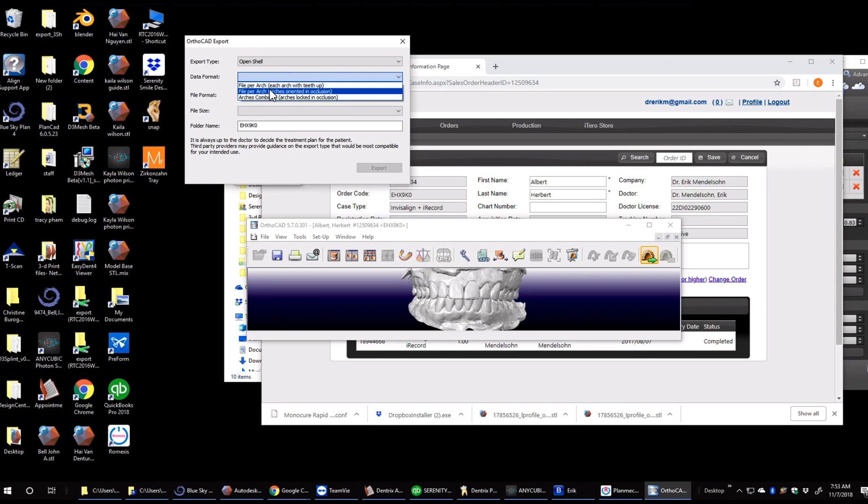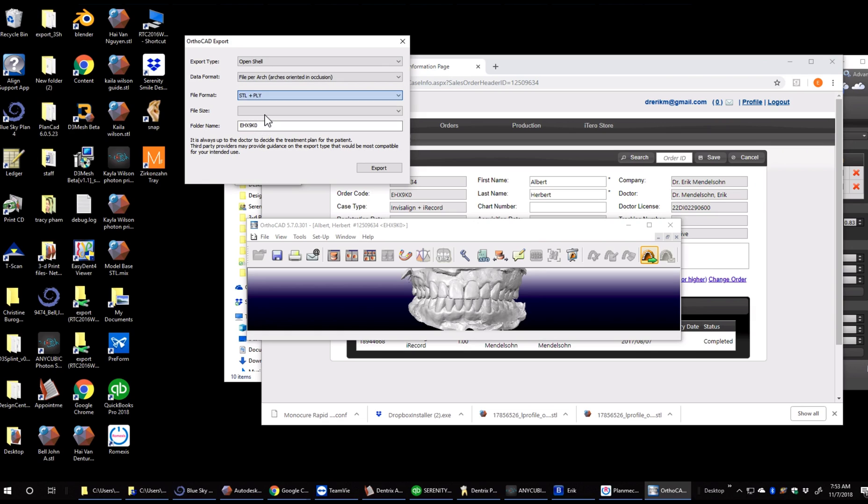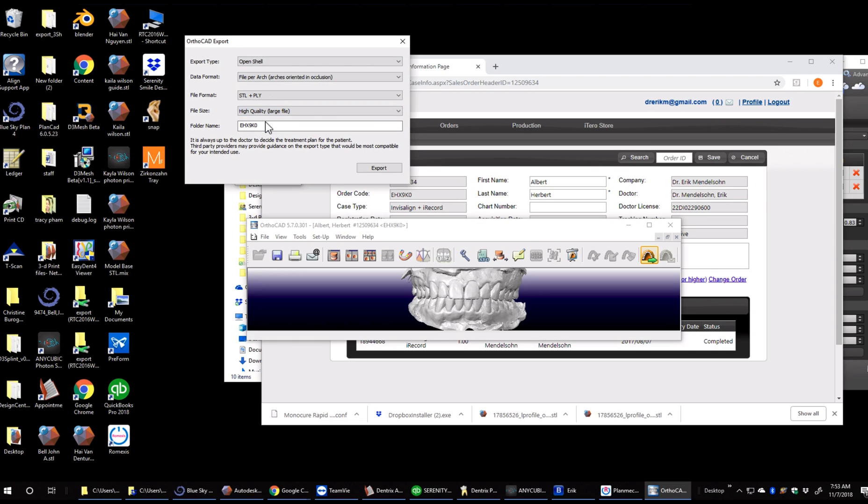Data format is always in occlusion, which is basically just our bite. STL plus PLY is the format, which is a stone model and a color model. File size we're just going to pick high. Then we're just going to rename the file. Now we click OK or export.